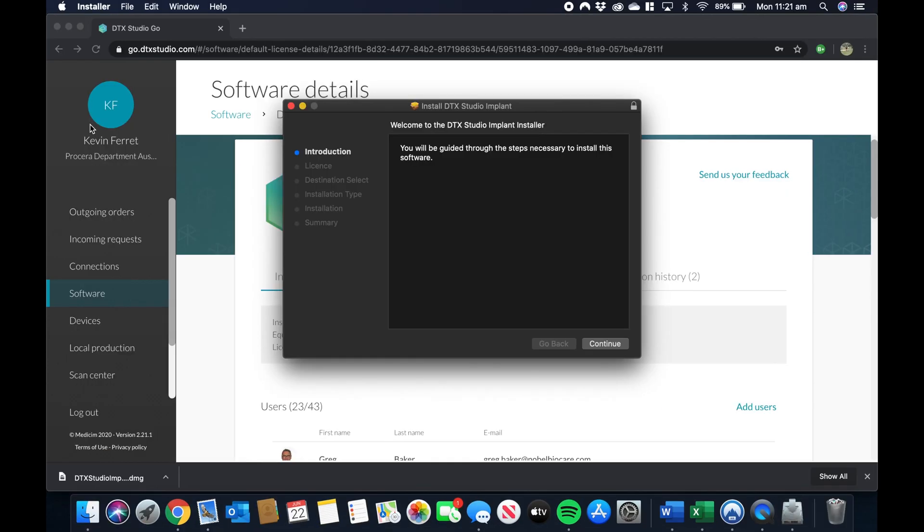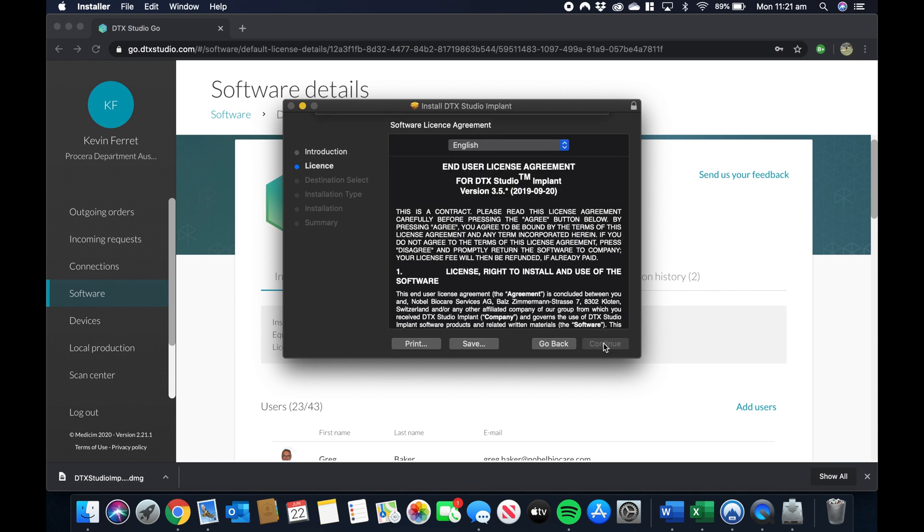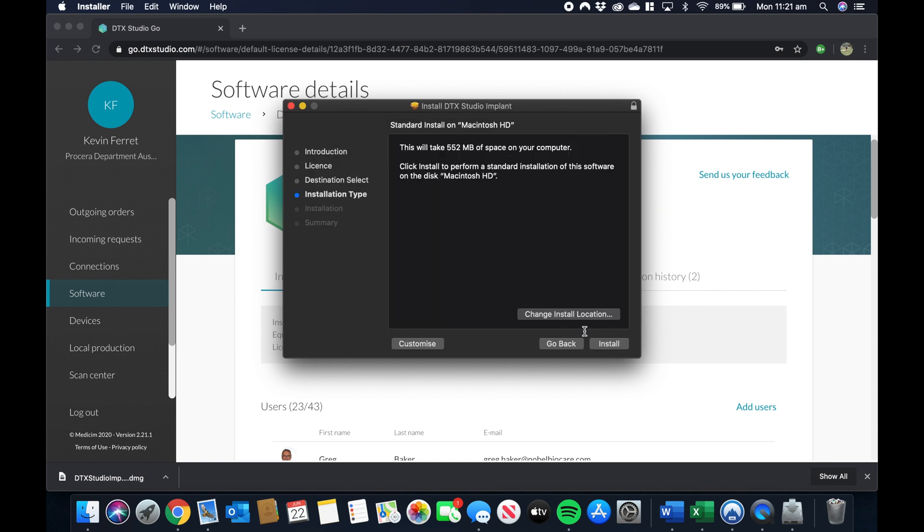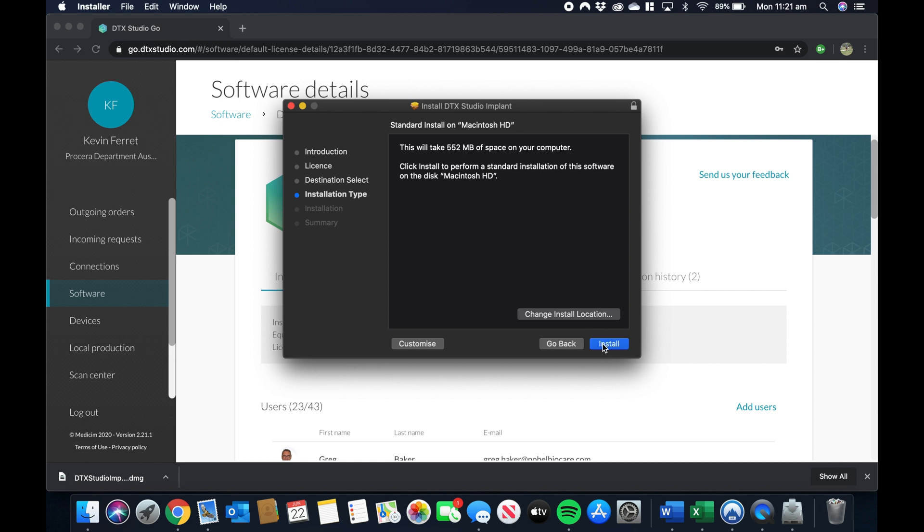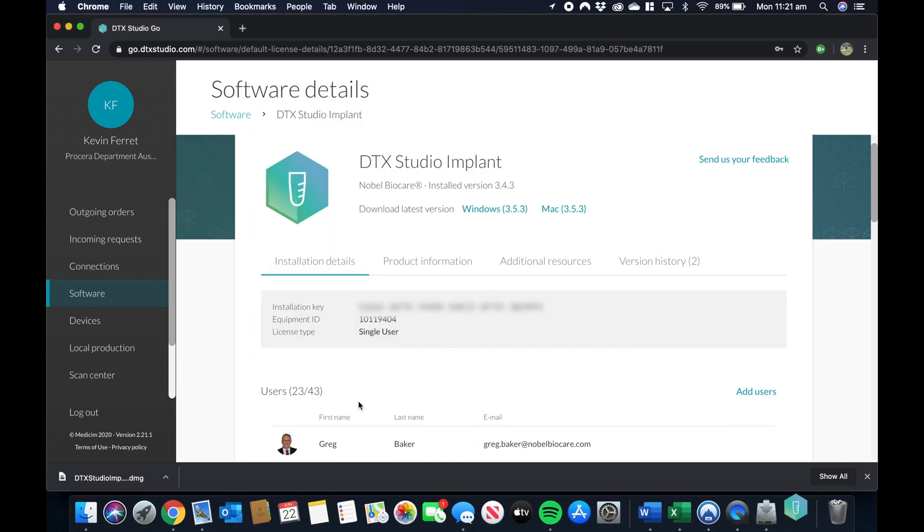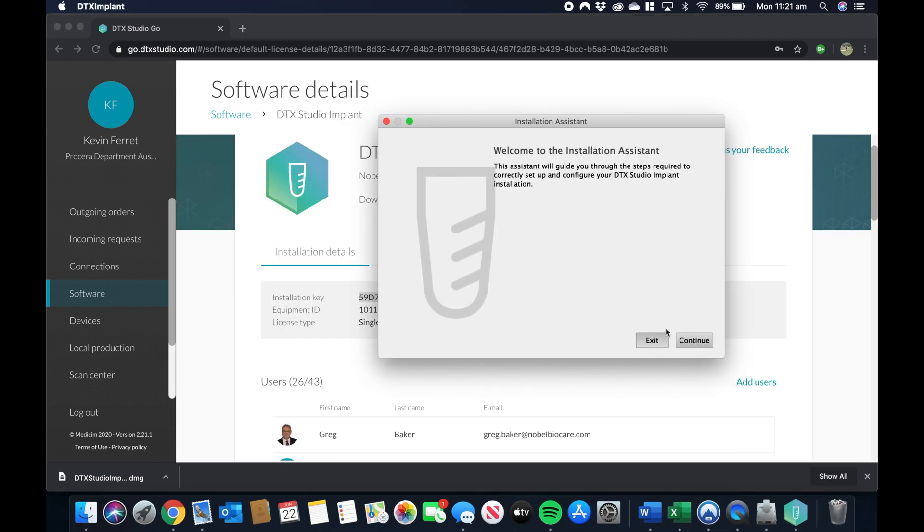This is going to start the installation. It's a pretty easy step-by-step installation. You're going to need to pick the disk you want to install the software in, press next, let the software do its thing, and once you're in there, the software is going to start the installation. Once this is done, the software is going to start.